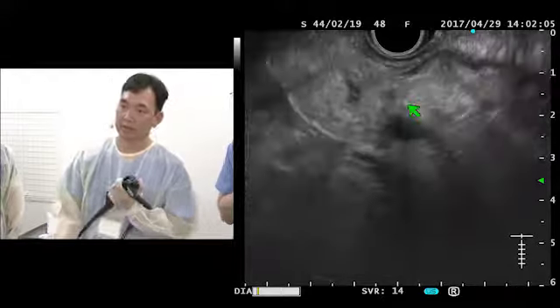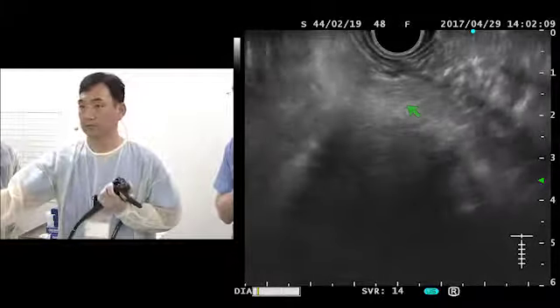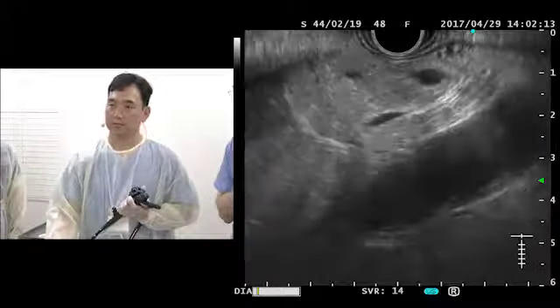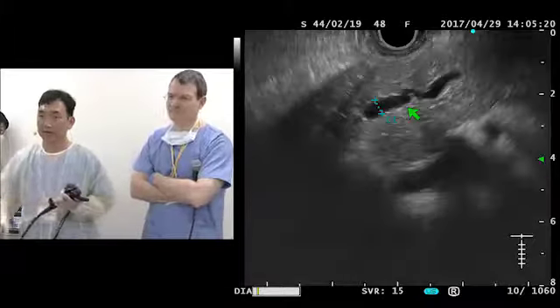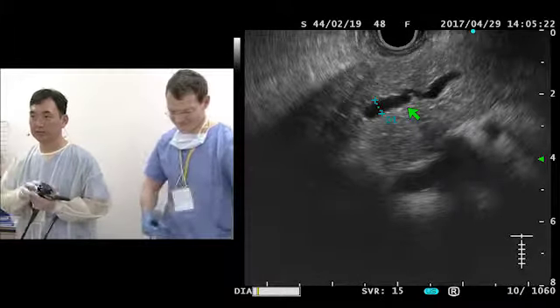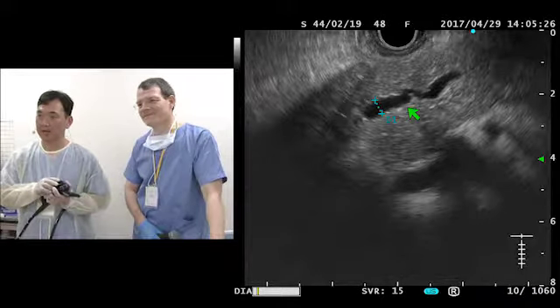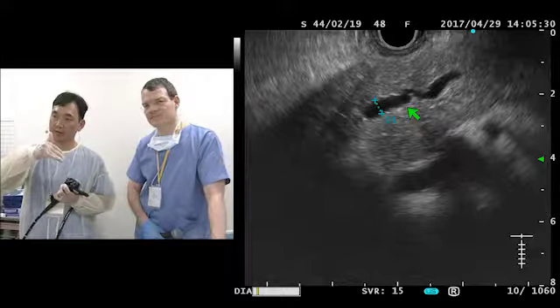Outlining of the pancreas body to tail seems to be rather benign. So let's focus on what's going on in the genu to the head. Thank you. As always, EUS is much more exciting. So I put an image up there. This is a transition zone coming from the pancreas body to the left side, which is the pancreas head.